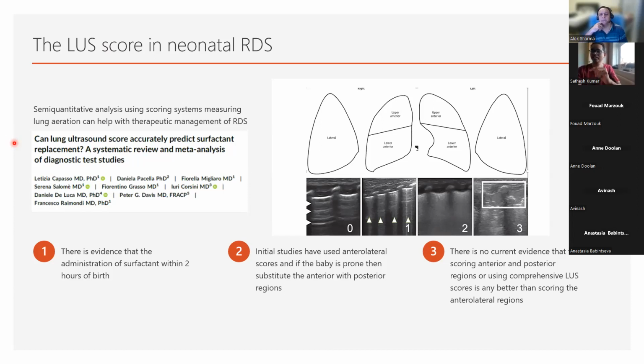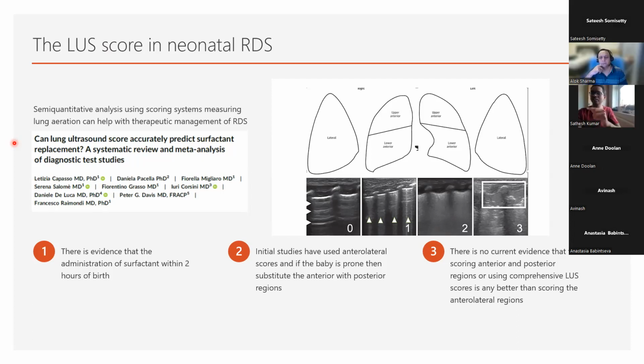But in this case, if I could have done a lung ultrasound, I could better justify my surfactant. But I had to struggle a lot in the morning handover to make the other team convinced that we required to give the surfactant. So that's my opinion. So, fair points. I've got Satish who's raised his hand. Go for it, Satish.